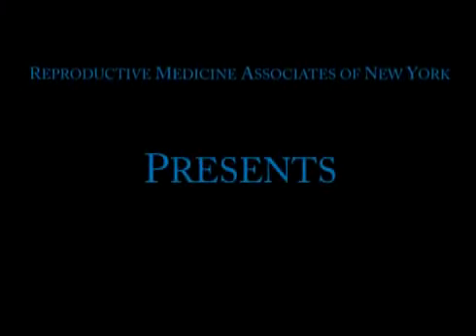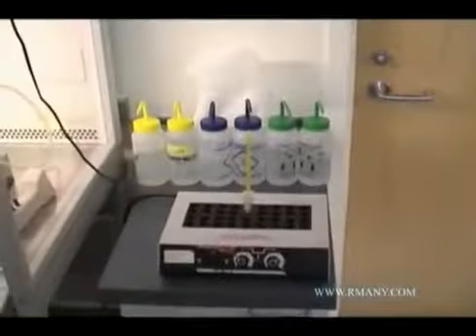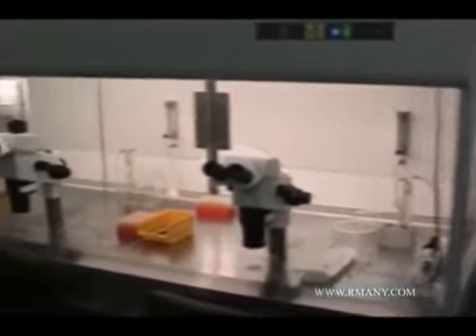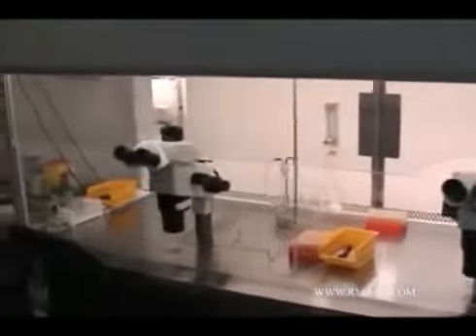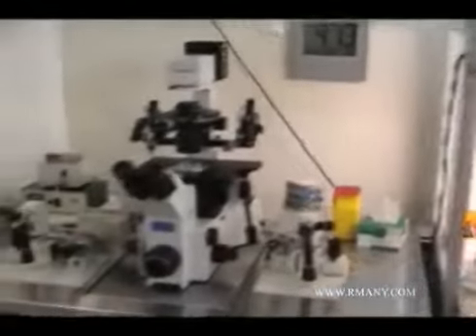Welcome to the Embryology Laboratory at Reproductive Medicine Associates of New York. This video will give you a brief tour of our laboratory and an introduction to some of the procedures performed for your IVF cycle. We'll show you an egg retrieval, an insemination and evaluation of egg fertilization, daily assessments of embryo development, and the embryo transfer procedure. We will also show you some special procedures, including intracytoplasmic sperm injection, assisted hatching, and embryo freezing.